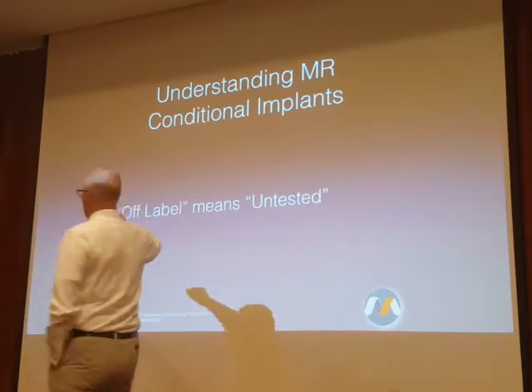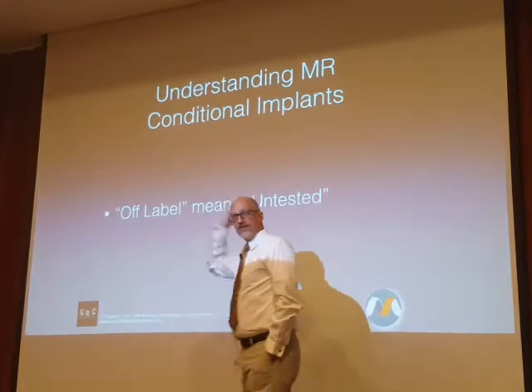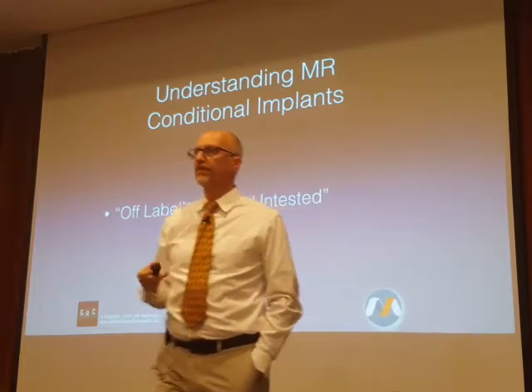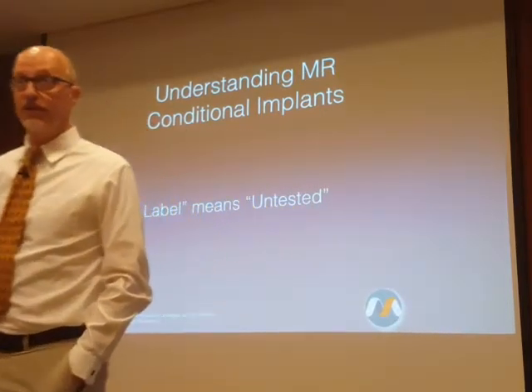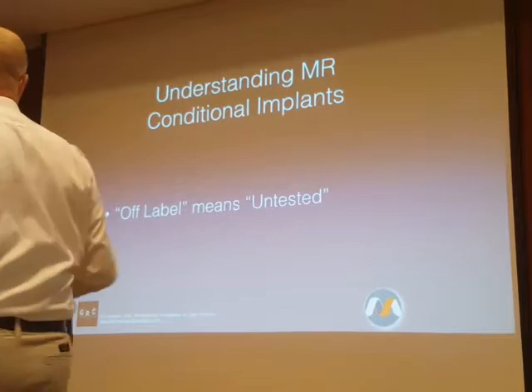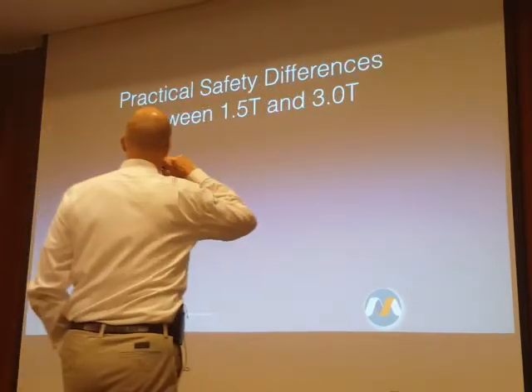So off-label just means untested by the manufacturer. Sometimes you can find third-party testing published in the literature that will make you feel more comfortable in other areas or exceeding the values. But that doesn't have to be the only way.